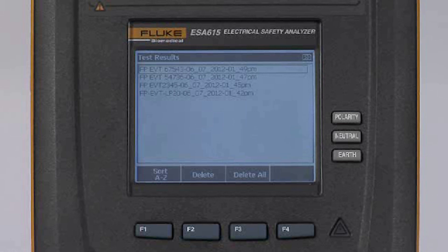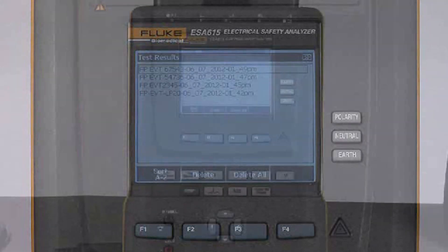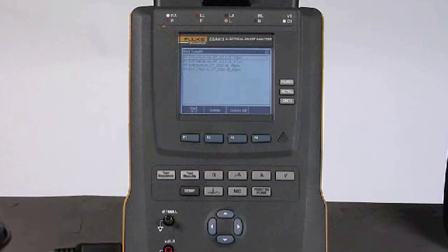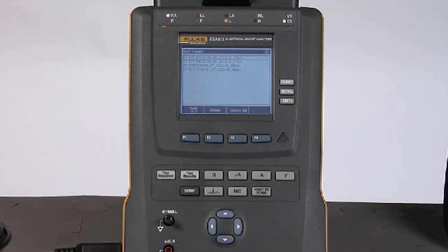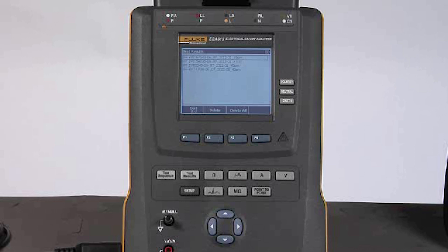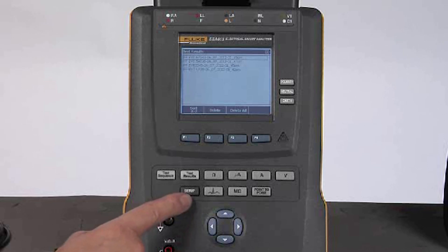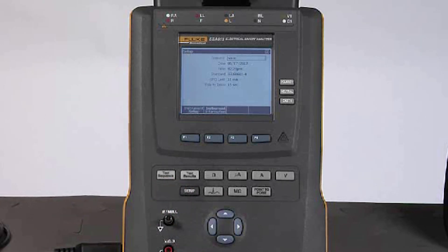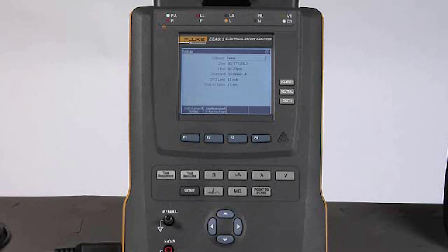The ESA 615 can also be operated manually, and when I do that, it's important that I take care to ensure that a couple of settings are properly made. I will press the setup button, and this allows me to select the operator or person who is going to be doing the testing. I can select myself or any others in the list, and I can have as many people in the list as I need.